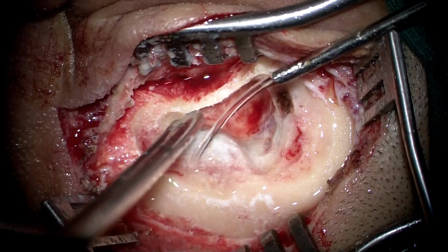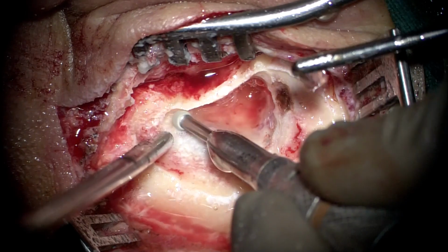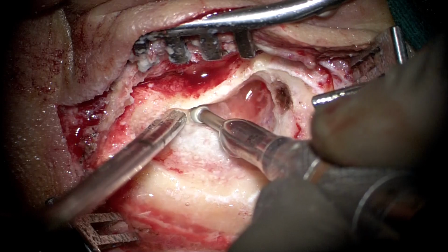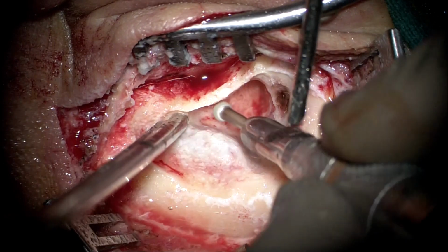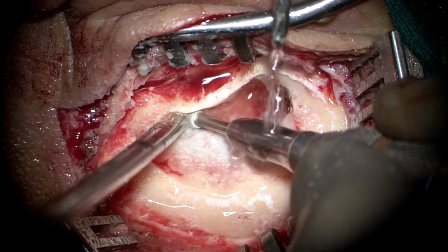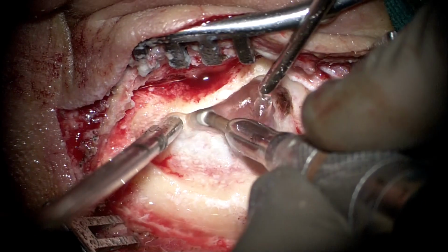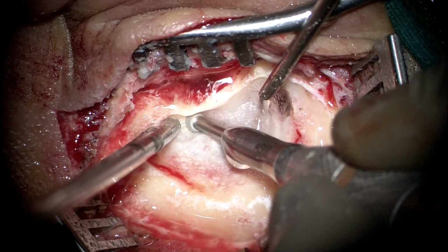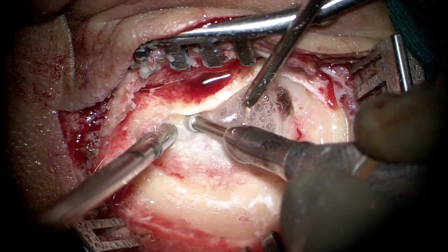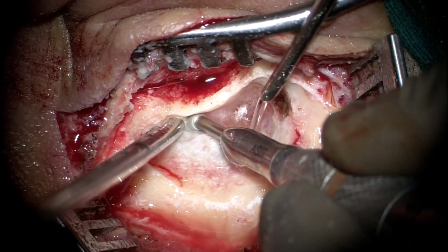In a highly pneumatized mastoid, one may not require this exercise, and the sigmoid sinus can be left behind, and you may have enough amount of cellularity in the front to be able to still accomplish this exercise. So as we see here, the inferior portion of the sigmoid sinus is now coming into view slowly and steadily with the progressive drilling. The drilling can be done normally medial to lateral. The burr size here is the most important part, and ample irrigation as well.